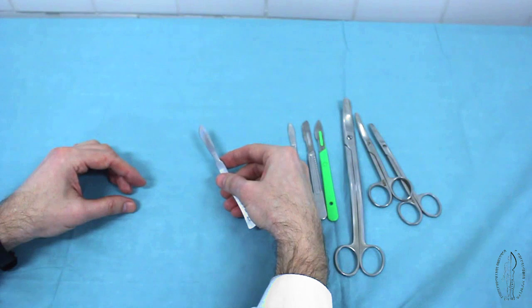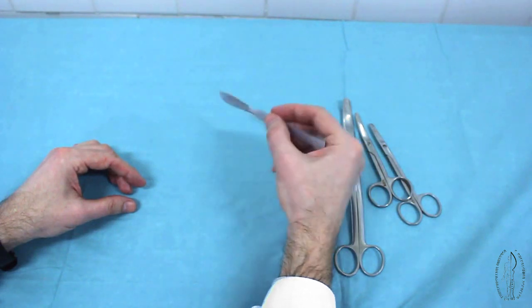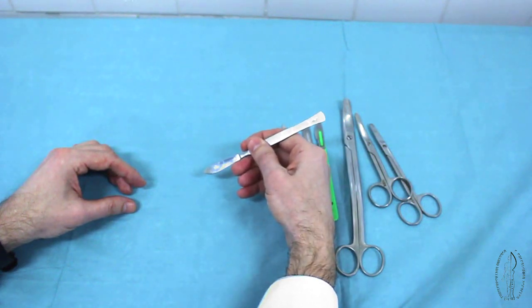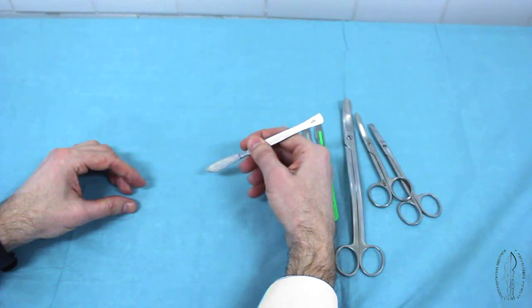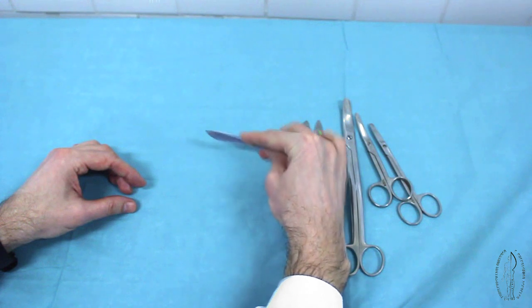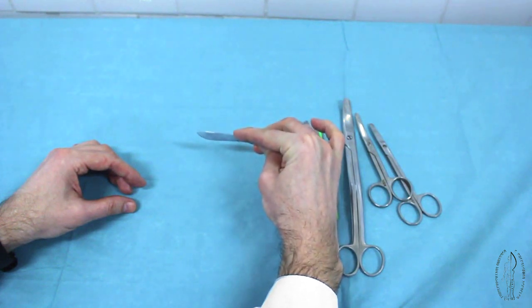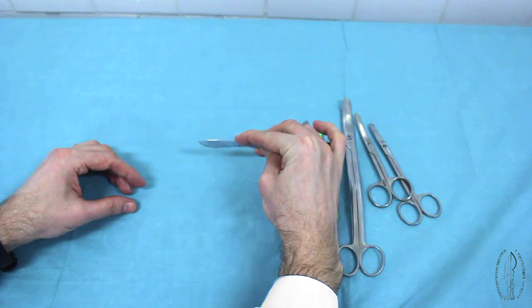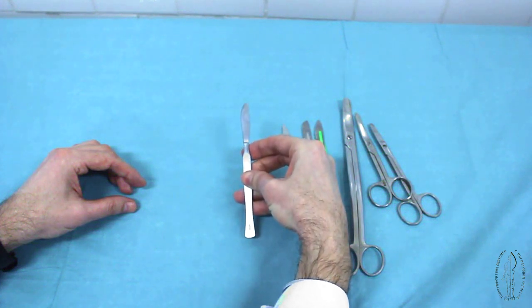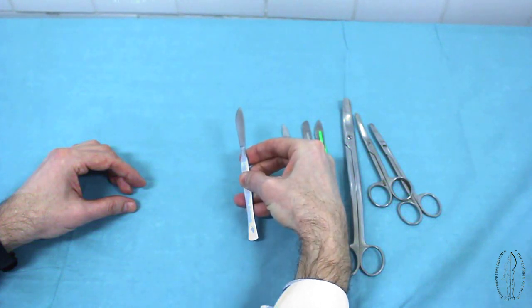The position of a scalpel in the surgeon's hand. A pen position: to perform short, not deep incisions with the tip of the blade, or for tissue preparation. A knife position: the index finger is located on the butt edge of the blade to increase force and make the incision deeper. A violin position: fingers are located on the side surfaces of the handle to perform long and deep incisions.